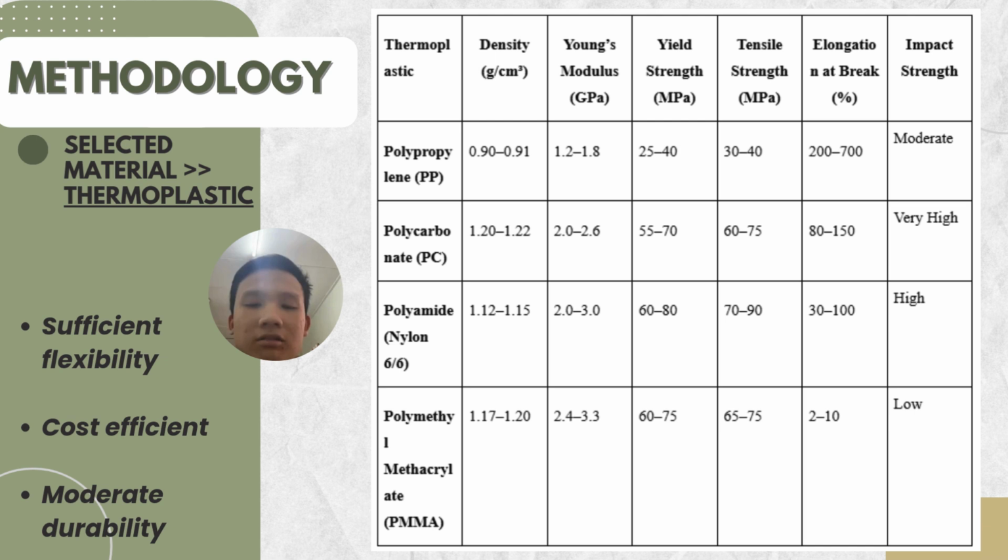That's all. Now, we are going to talk about the most important thing in our product, the AFO, which is the selected material for its overall body, which is thermoplastic. So why? There are three reasons here. Firstly, it has sufficient flexibility for the users to undergo the gait, at which it can control the range of movement but not zero overall.